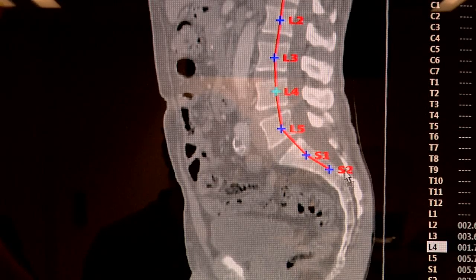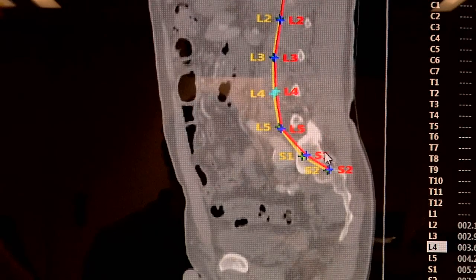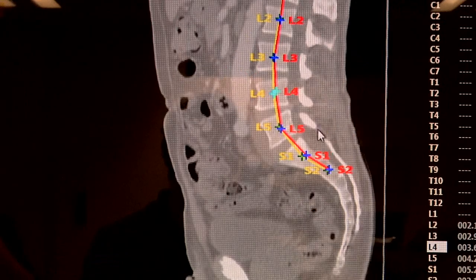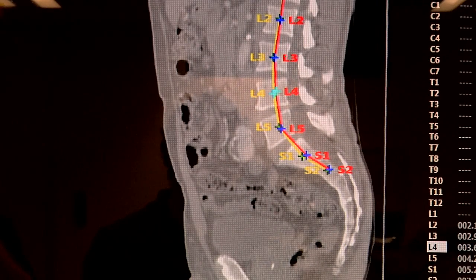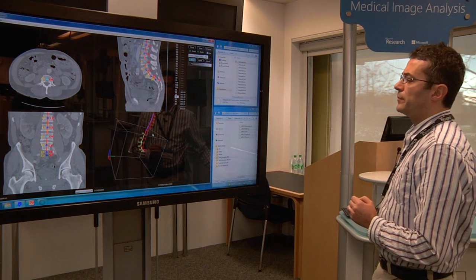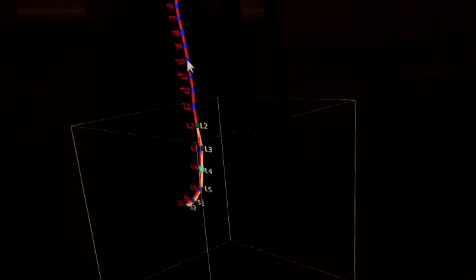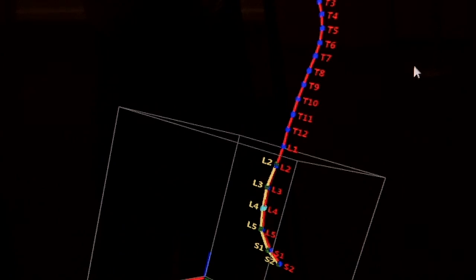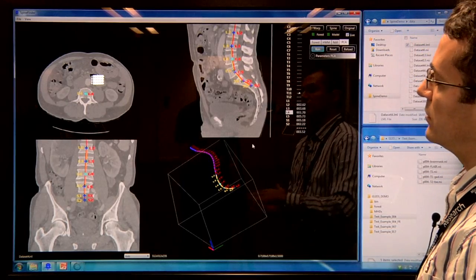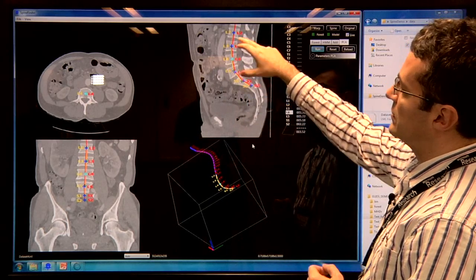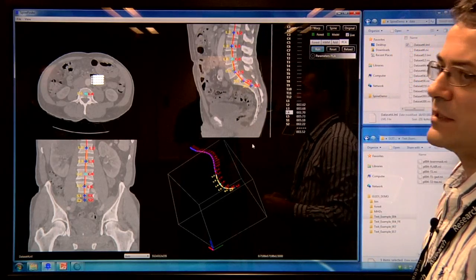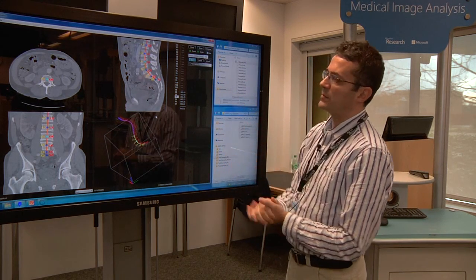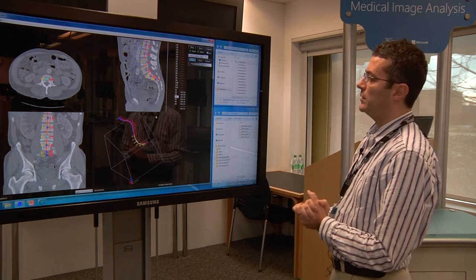We can also compare and quantitatively measure how well we do with respect to some ground truth labeling. Now you can see in red the automatically detected vertebrae and in yellow the ground truth position, and there is very good alignment between them. Importantly, in this demo we can detect the spine and identify which vertebrae we're looking at no matter what type of CT scan, no matter what the resolution, and no matter what scanning machine was used. More importantly, no matter how much of the human body we can see — like in this case where we can only see the abdominal part and the thoracic region is missing — we do not need to see the whole body. The generalization capability of this system is quite important.